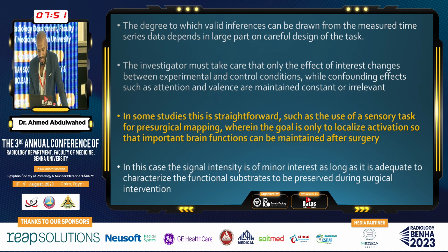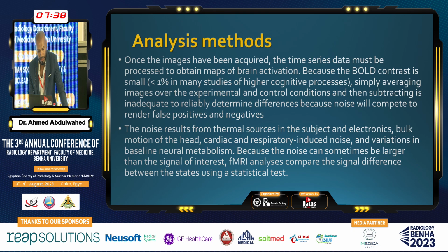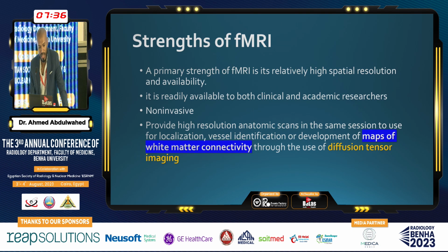In some studies, this is very straightforward, such as the use of sensory tasks for pre-surgical mapping, where the goal is only to localize the activation that is important for brain function that must be maintained after surgery. Let's skip this analysis. What are the strengths of fMRI?